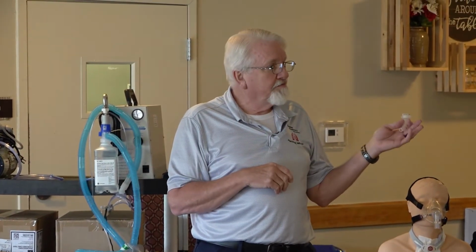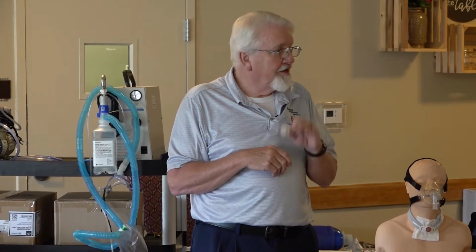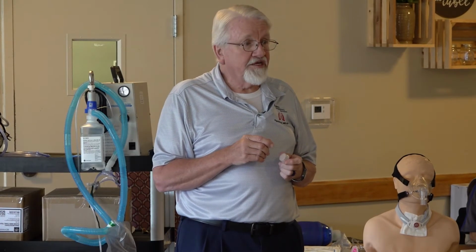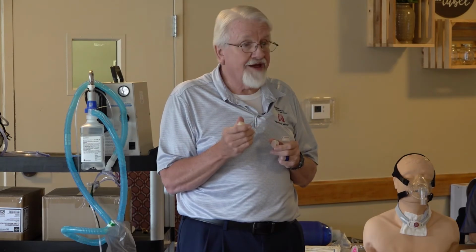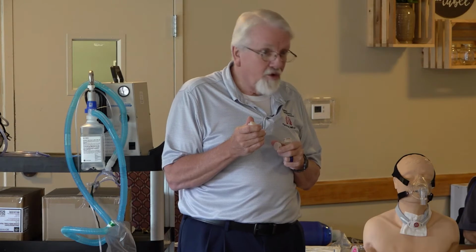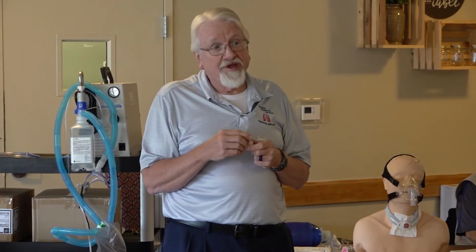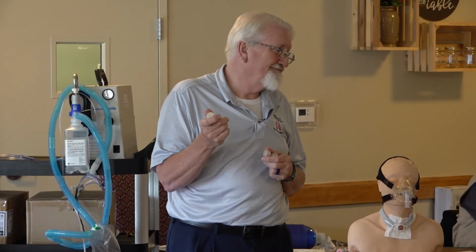When you're in bed asleep at night, you're going to use the one with high moisture. The bad thing is the patients usually can sense the one with the high moisture, because there's more resistance to flow, and they can sense it when they're trying to breathe. So they use twice as many high flows versus high humidity.